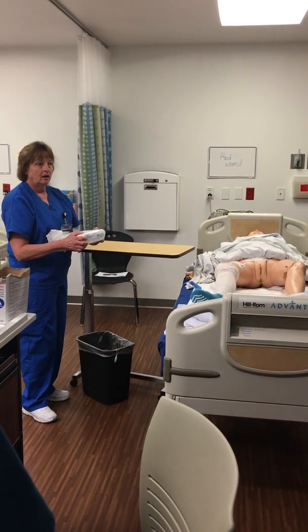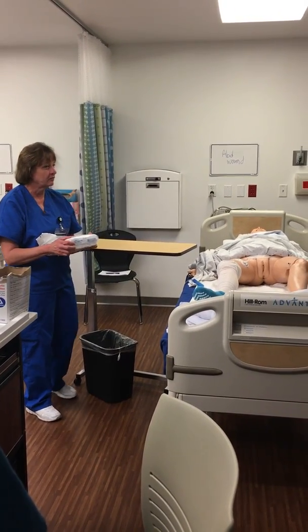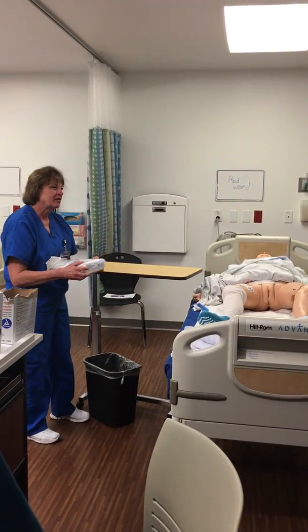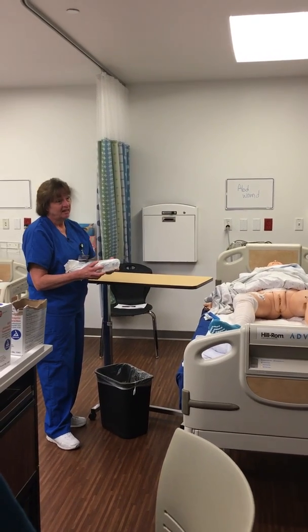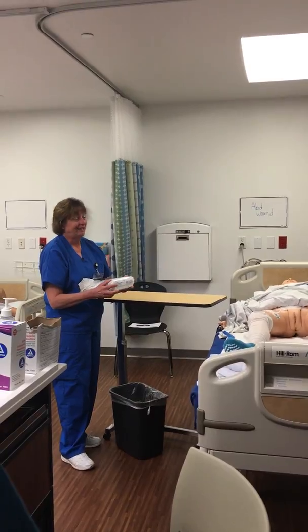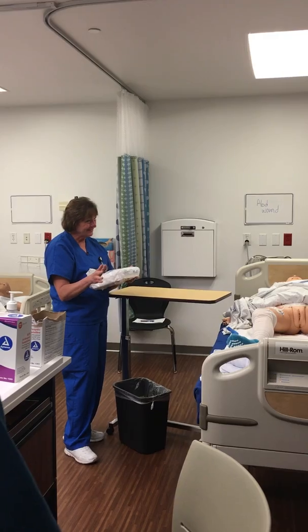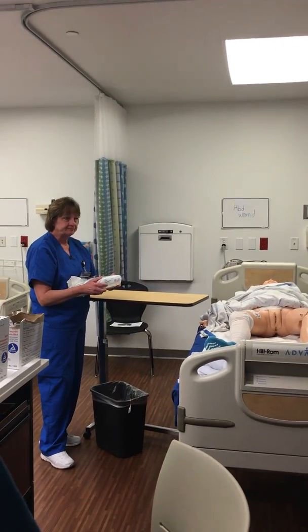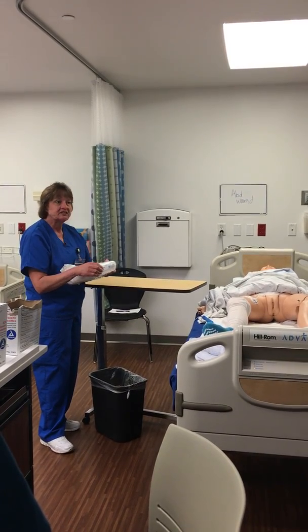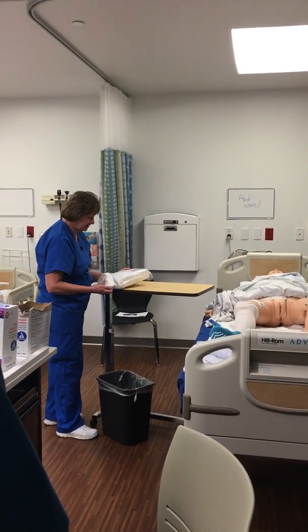How do you determine size? We would always go with a 14 unless somebody's had a catheter in for a long time and it's been established. When I was in home care, I had patients who had catheters for actually years and they were size 22 or 20, with a 30-milliliter balloon — but that's unusual. If it's on the doctor's order, it may or may not specify. So we grab the smallest one. The 14 is a good size. In pediatrics you go 6, 8, 10s — it just depends on the size of the child.